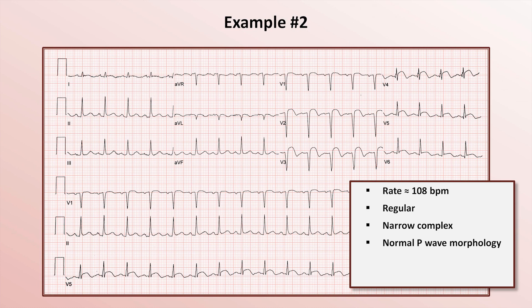What is the relationship between P-waves and QRS complexes? There is a one-to-one relationship with each P preceding each QRS, along with a constant PR interval that is less than 200 ms. Our diagnosis here is sinus tachycardia.